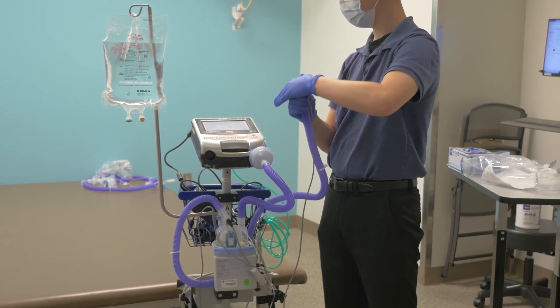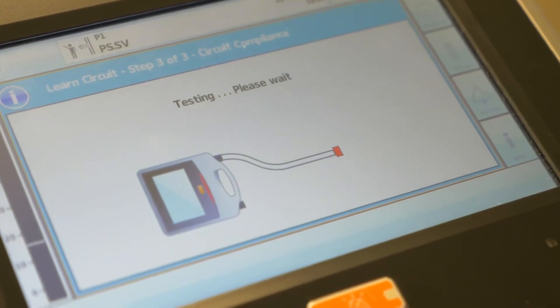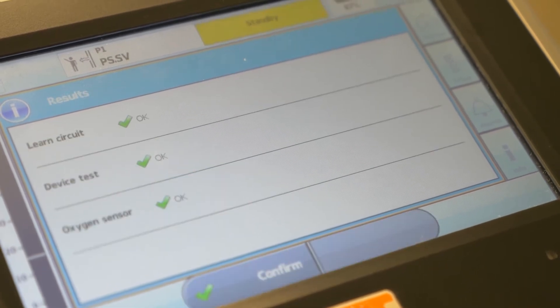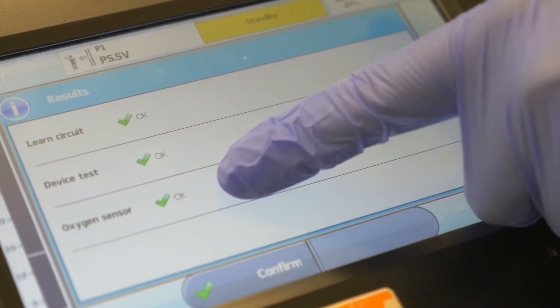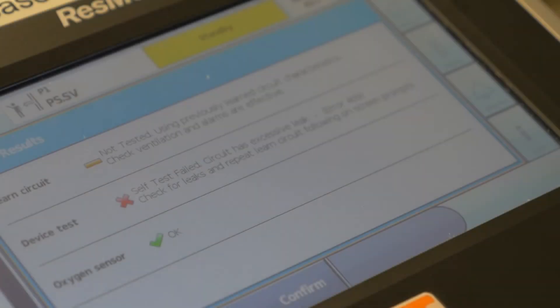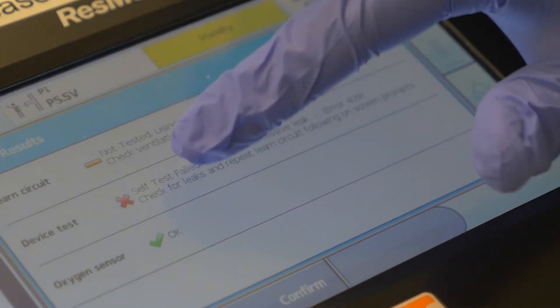After this step, the machine will show the results of the test. If the screen shows three green check marks, this means the test was successful and the machine can be used. Do not use the ventilator if you have any red or yellow symbols. Please call your home care ventilator company for assistance if necessary.